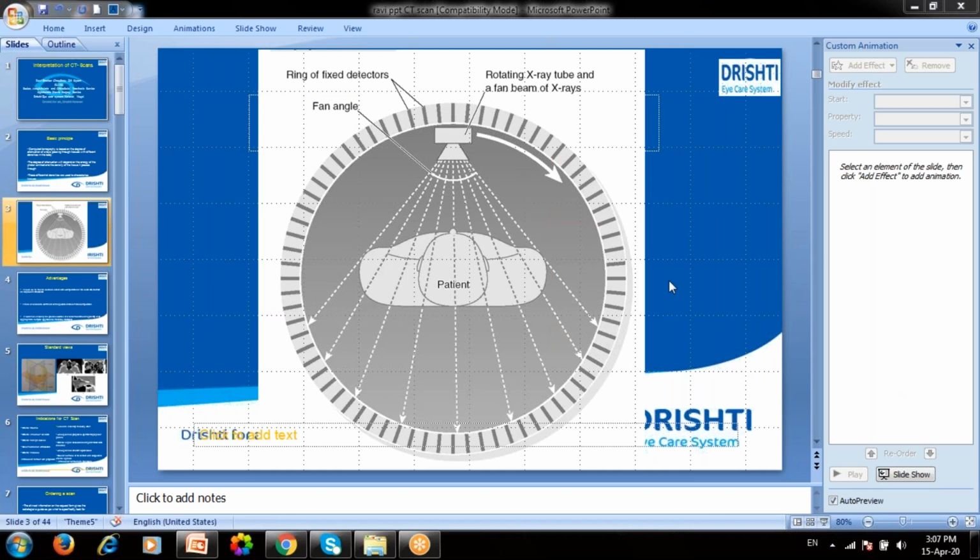Okay, dynamic imaging. Yes, okay, sir. So what is different in dynamic? They increase the rate of the scan. Like if it is 1500 scans per minute, then they increase it a little bit more. If you want finer detail, then MRI has to be done. Generally in fracture cases, and if you think there is any injury in the brain, in those cases the dynamic scan has to be done.